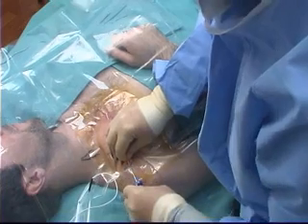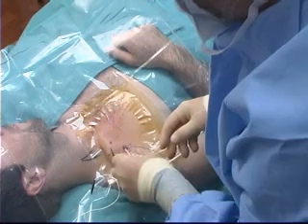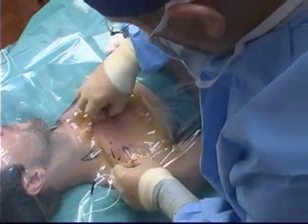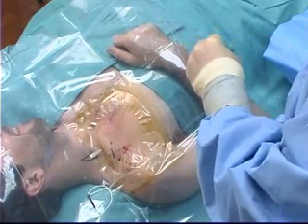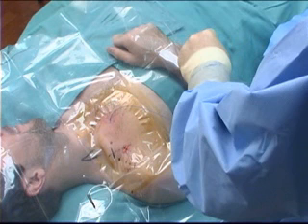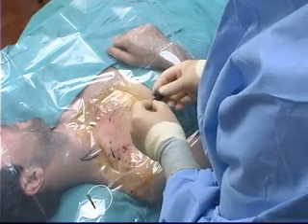A special tunneling device can now be used to tunnel the catheter subcutaneously, or the Tuohy needle and its stylet can be used. Tunneling is essential to prevent catheter dislodgement. The skin bridge may be used for short to midterm catheter use since this can facilitate easy catheter removal. The price of this is a higher incidence of leakage around the catheter. This leakage may be offset against tunneling without a skin bridge, which may in turn make catheter removal slightly more difficult. The snap lock is attached to the proximal end of the catheter.